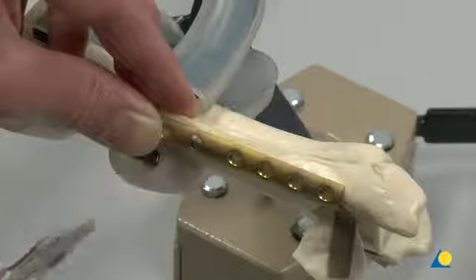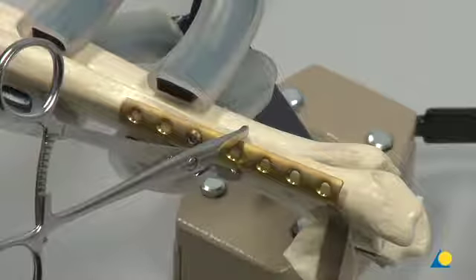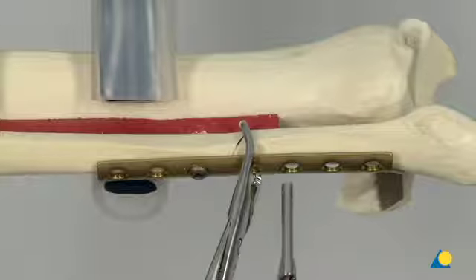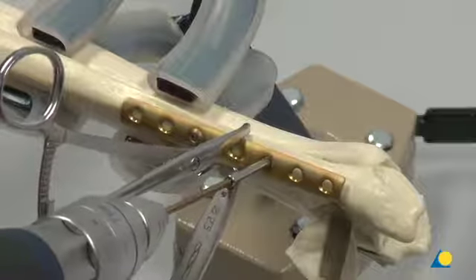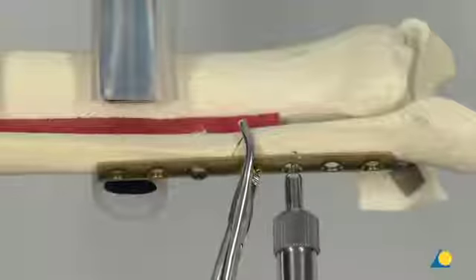A final fracture reduction is performed over the plate using the toothed reduction forceps. Clinically, pointed reduction forceps can also be used from a medial-lateral direction, however this requires more soft tissue dissection. The 2.5 mm drill bit is used to drill eccentrically through the third distal plate hole. The depth gauge is used to measure the required screw length.